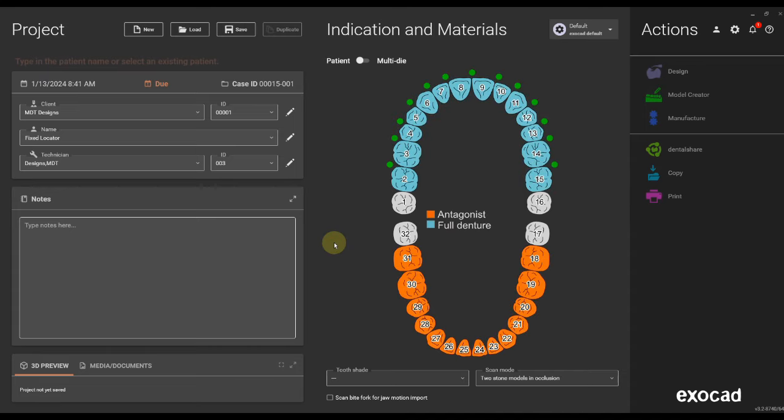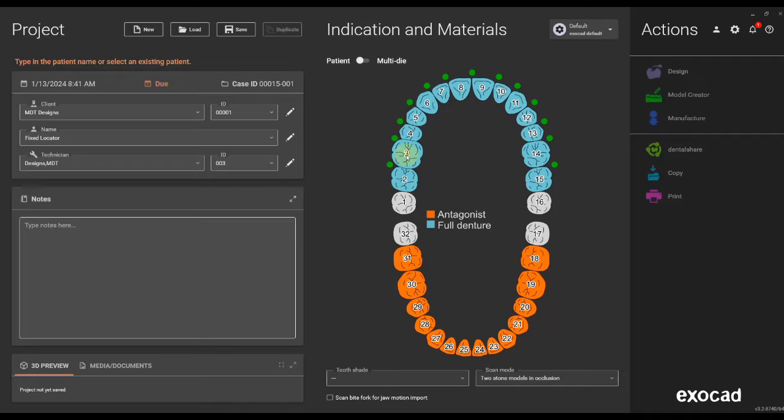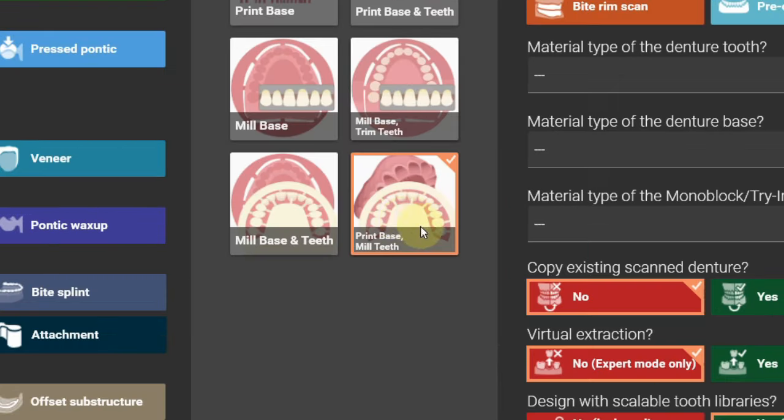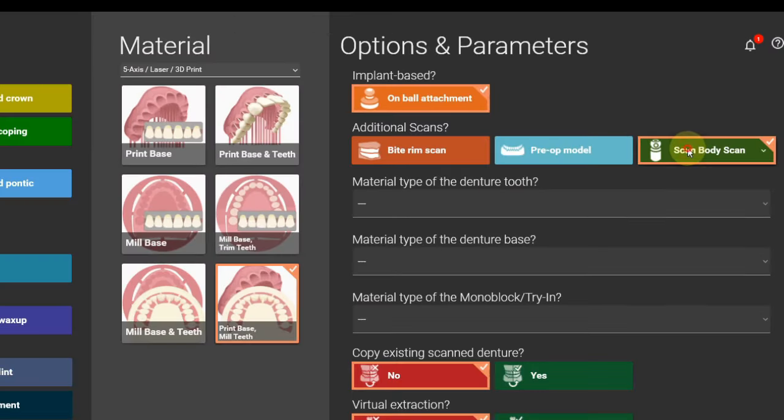When selecting the teeth where the locators are positioned, you need to click on one of the teeth and then select the new feature on ball attachment. Make sure the production method materials are still the same since that could cause an issue in the workflow.